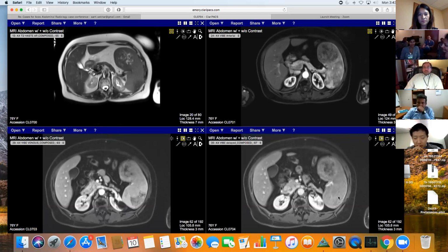But I like the googling, this idea about the extramedullary hematopoiesis and seeing how they could be varied if they have different components of the myeloid components. Yeah. There's some things there you'll see that look a lot like this.